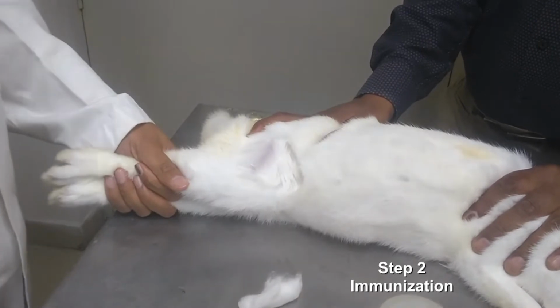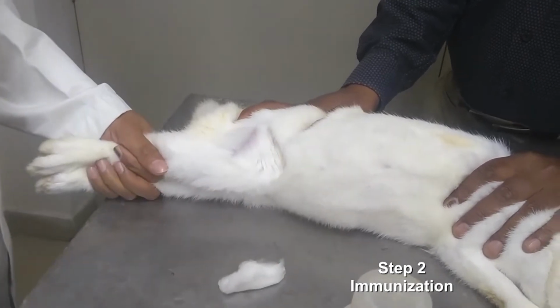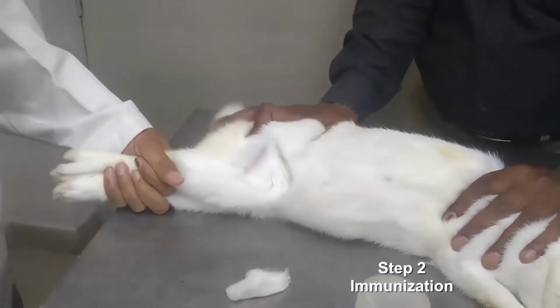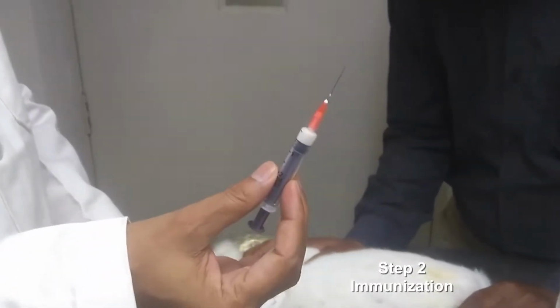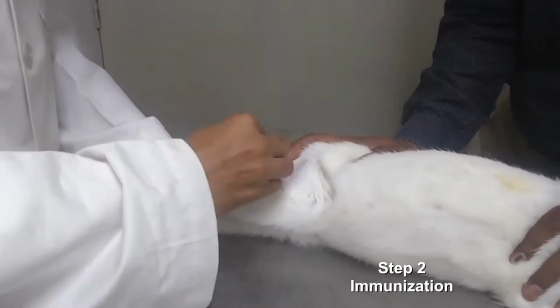There are two kinds of injection that we give. One is intradermal and another one is subcutaneous. So today we'll be doing a subcutaneous injection. This is our emulsion that we have prepared by the micro-emulsifying needle. We have seen it right here. This is the area where we would like to inject.